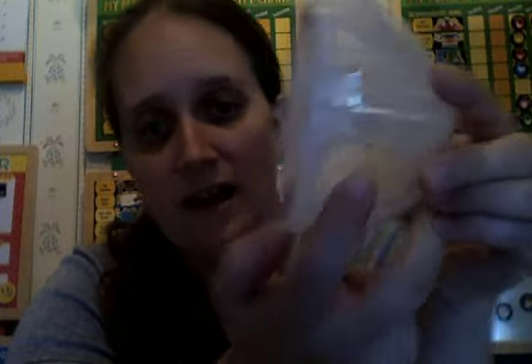These new ones are really kind of cool. I haven't tried these yet, because I wanted to do the video before I actually use them, but I've still been using my old ones, and they're pretty much exactly the same. I did notice there are lines right here that actually give you ounce counts, which they never used to have. There's also lines on the side that give you ounce counts. So there used to not be a way to tell how much you had in one of these. They say their top is 8. You can get 8 ounces in one of these. I've gotten 10. It's kind of precarious. Don't bend over. Don't move real hard, but you kind of can.